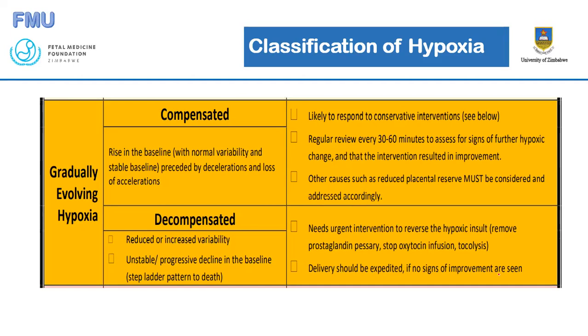We have to do extensive training of ourselves, and we also have to do CTG meetings where we review these CTGs. But I have no doubt that in our situation, where our baseline for neonatal outcomes, for MSBs and FSBs, is so high, CTG will certainly make an impact if everybody puts their hands on deck.